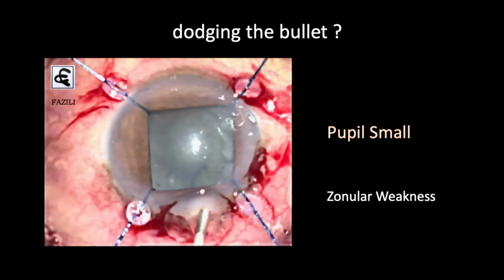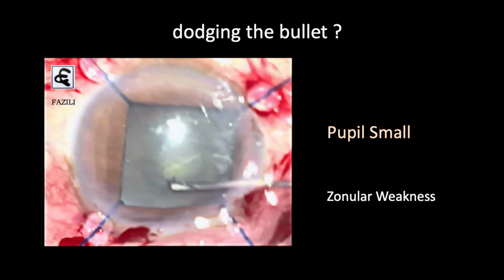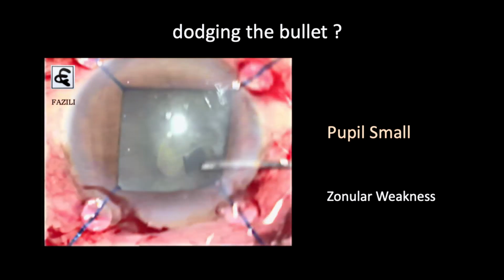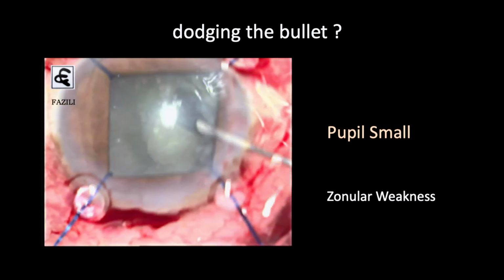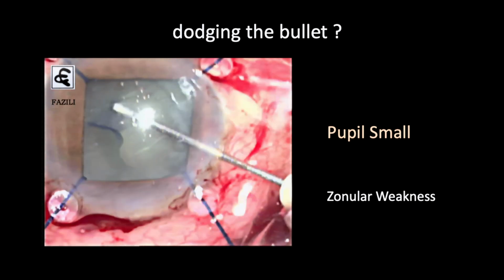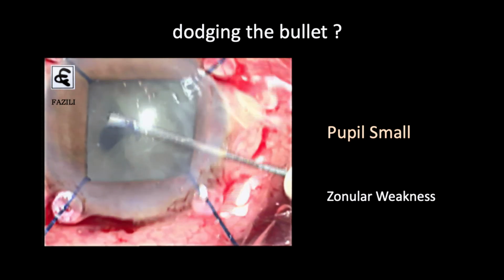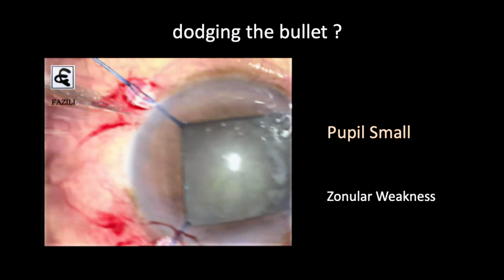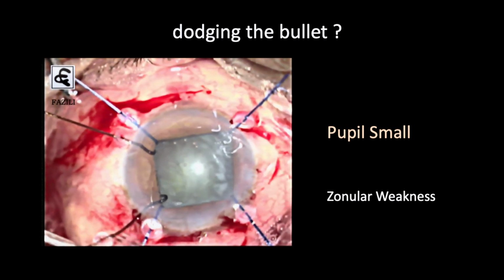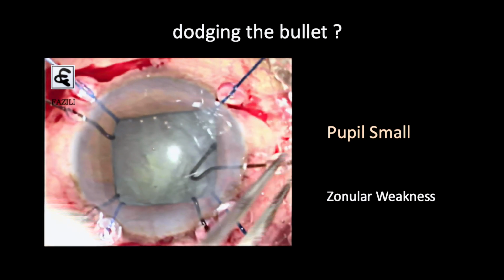Then there is another matter of a small pupil with zonular weakness. Now here I have already put the hooks in and then am doing a rhexis. Again, as I told you, as you initiate it and as the rhexis progresses, you know that there could be signs of weak zonules, which you might not have picked up preoperatively. You can see here, I'm facing a lot of problem, and you can see the bag moving on this side. So I complete this rhexis, and then I go ahead and make separate ports very close to the iris hooks, or the position can be a diamond configuration at around opposite sides, but you can make them nearby.